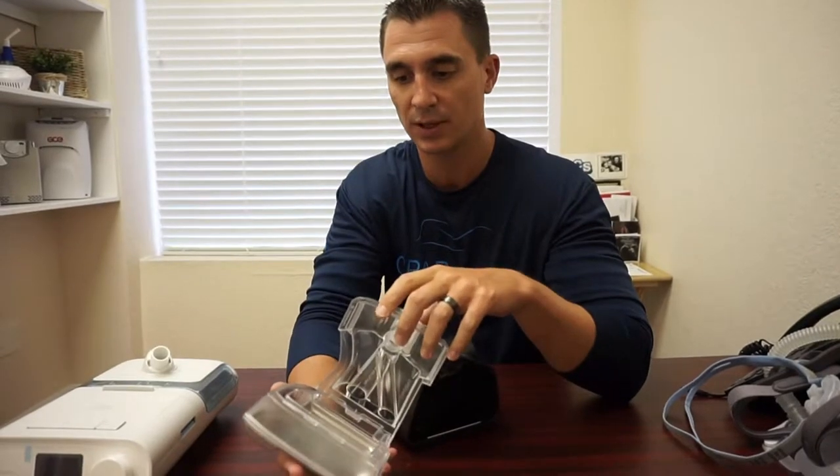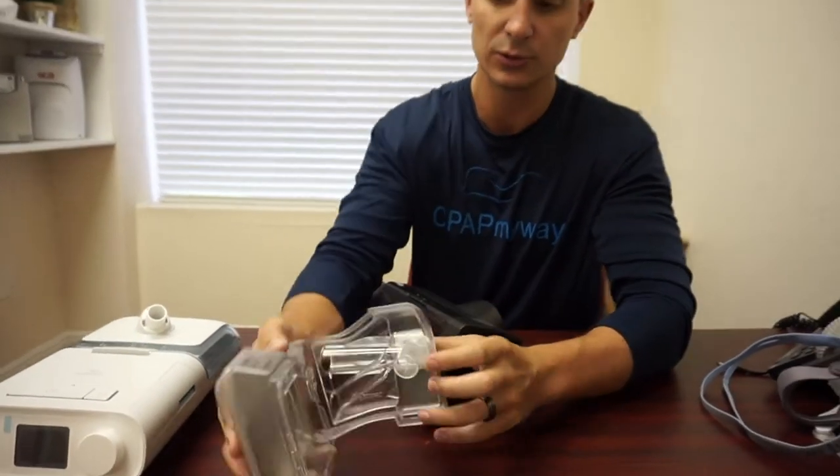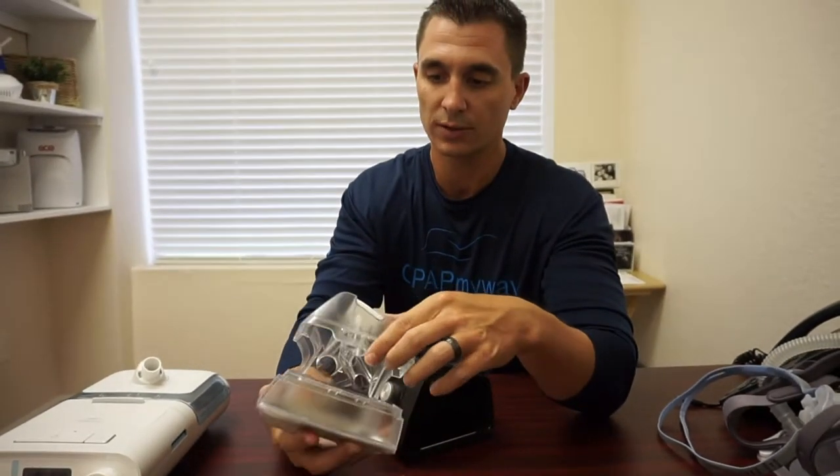And then on the side, you've got a water chamber here. Same deal — it pops open on this one. It's a covered water chamber. You need to dump it daily after use, wash it with soap and water at least once a week, fill it before bed, and set it back up for use again.